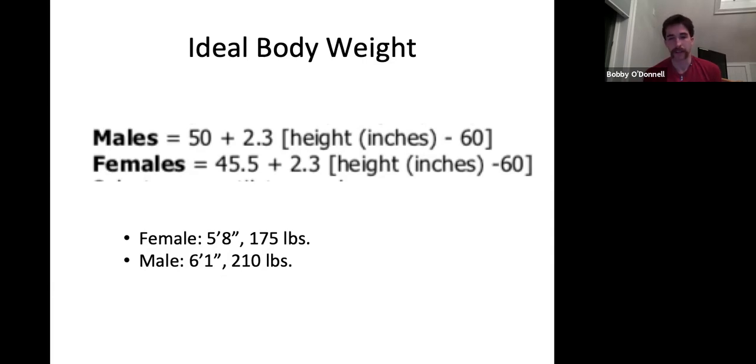And it's the same thing with the male. Their ideal body weight is going to be 80 kilograms off of their actual body weight, which is 95.5. So that becomes pretty significant when we're calculating our tidal volumes and we're trying to use these lung protective strategies because we don't want to overventilate them. And that's a really important concept. So to reiterate, our tidal volume, we're starting at 6 cc's per kg of their ideal body weight. So whatever their ideal body weight is, multiply that by 6, and that should be your starting tidal volume, okay, in the basic AC mode patient.